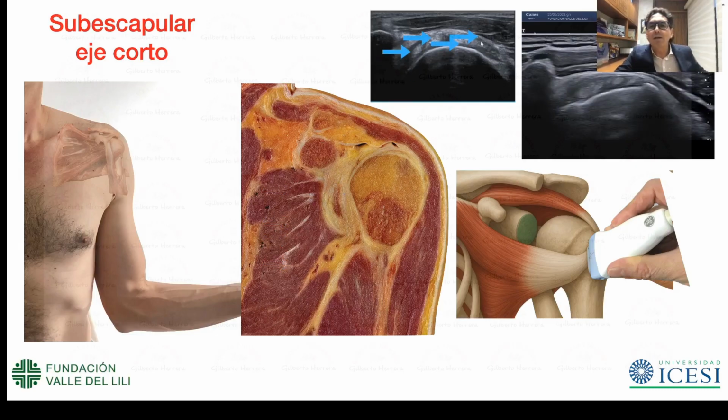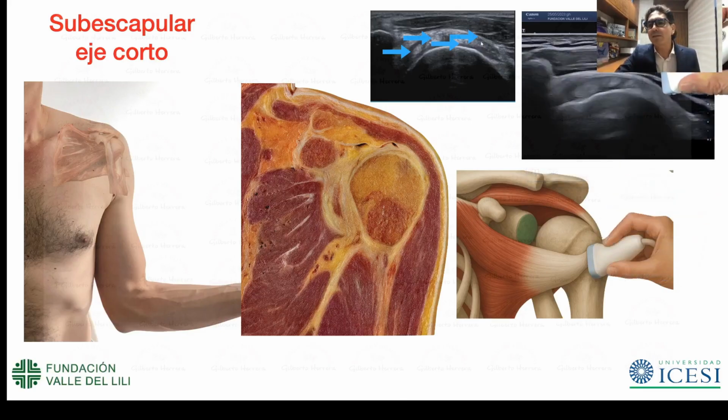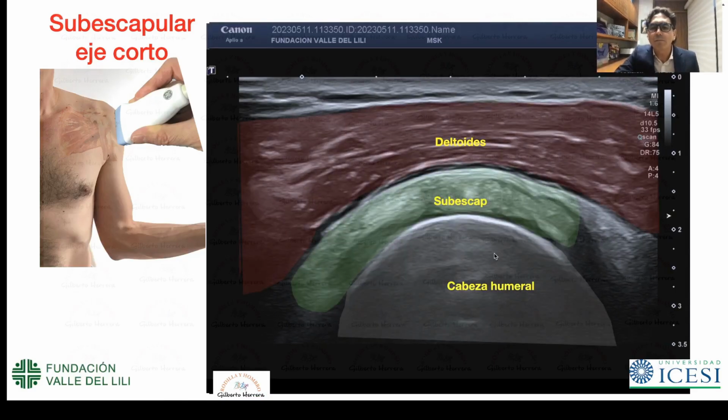Look at the subtendons that can be perfectly identified in our ultrasound. And we can see them clearly, in this example, position 1 subscapularis. Short axis, that's the position. To see our image, let's look at it here again and more dynamically. So short axis of the subscapularis, which corresponds to the long axis of the biceps. Look at the position of the probe. The previous one was at 90 degrees with respect to this position.